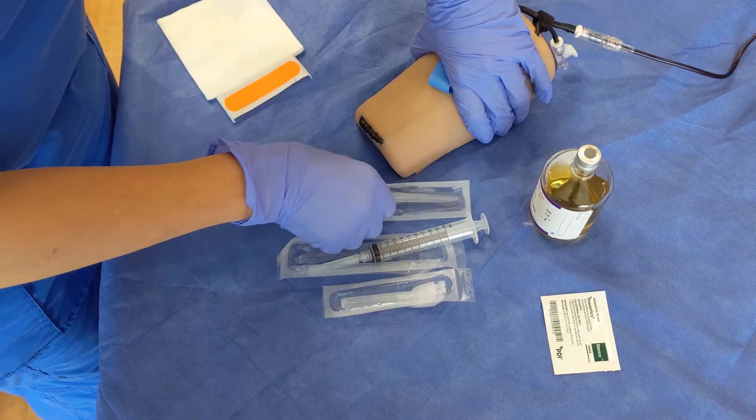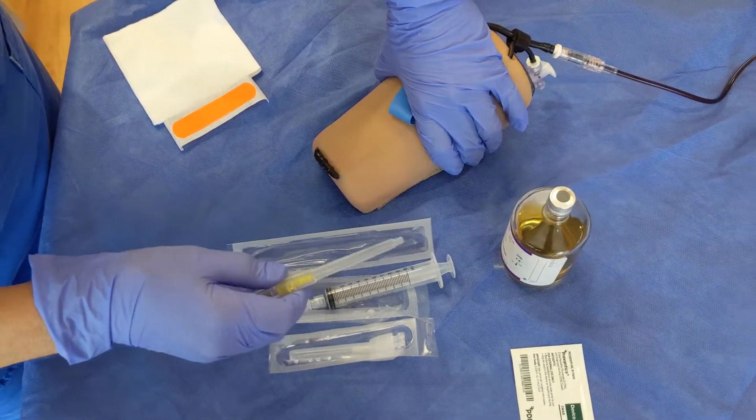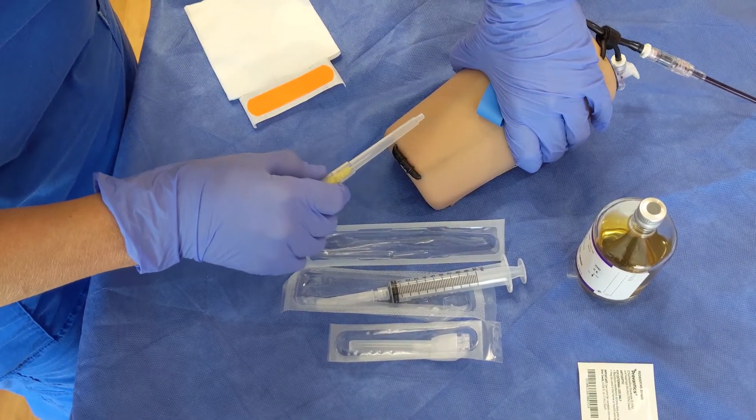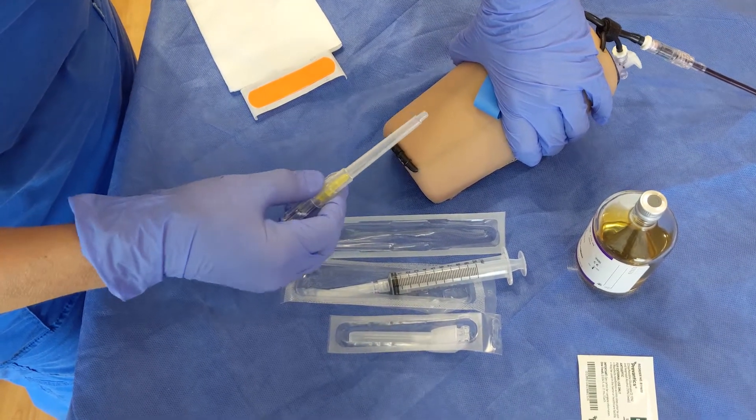The problem sometimes that we have with using a butterfly is when you insert that needle, sometimes you go all the way through the vein. And then when you try to get the blood back, nothing happens.